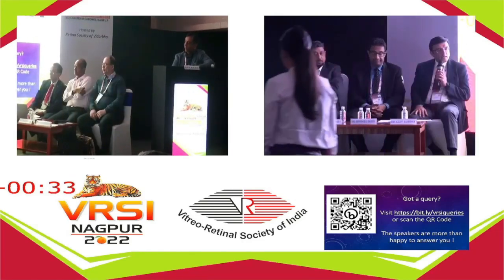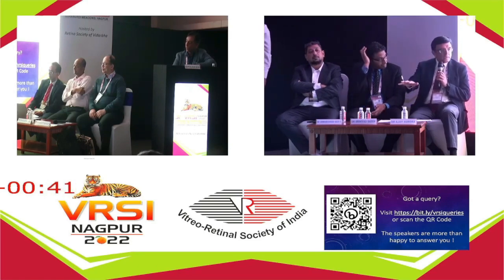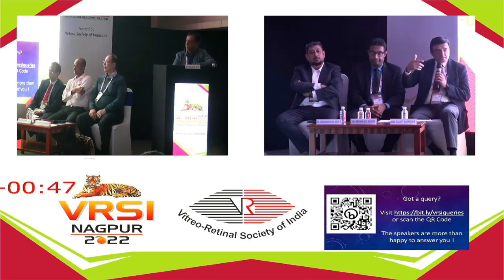Just two points, Manish. One great advantage is the eyelashes, and the advantage comes from the point that you have access to the patient's eye and can introduce an earbud and lift the lid. But this is a session for instrumentation, so I just wanted to bring that out. While in other machines you may not have access to the lids, Mirante permits you access to them.